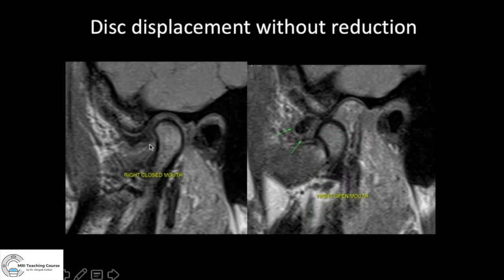Look at this case: mandibular condyle is here, nothing above it — the disc is clearly displaced anteriorly. Sometimes you can get confused by the lateral pterygoid attachment: is that the disc or where is the disc? Look at this area — there is no normal disc here, and this is displaced anteriorly. On opening the mouth, the disc is not going back to its normal relation with the mandibular condyle; it remains anterior. So this is disc displacement without reduction.